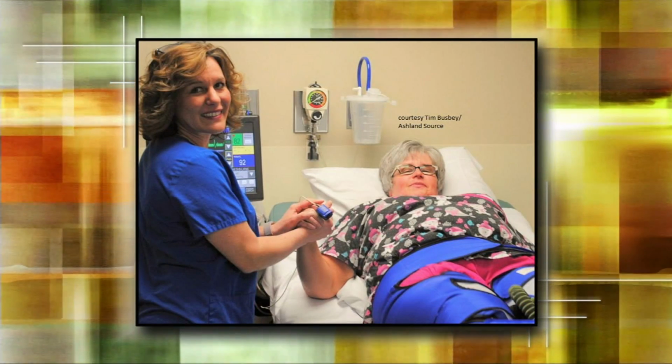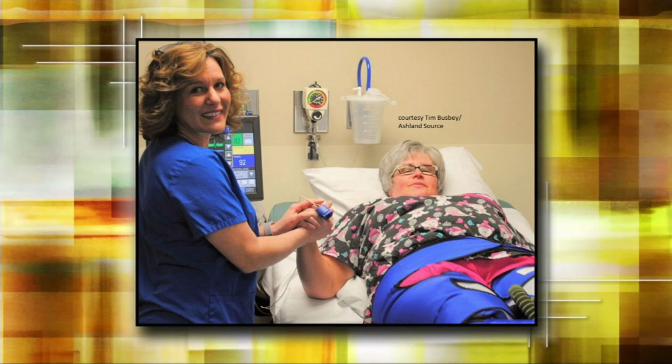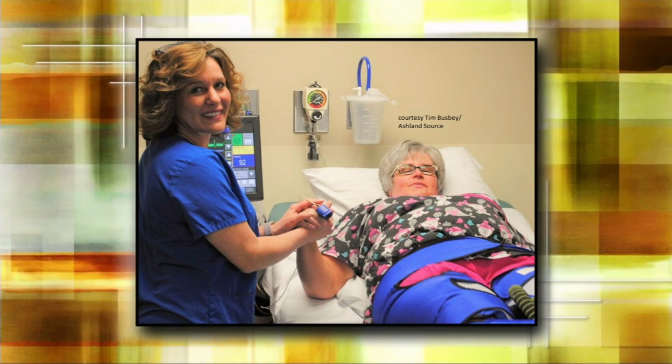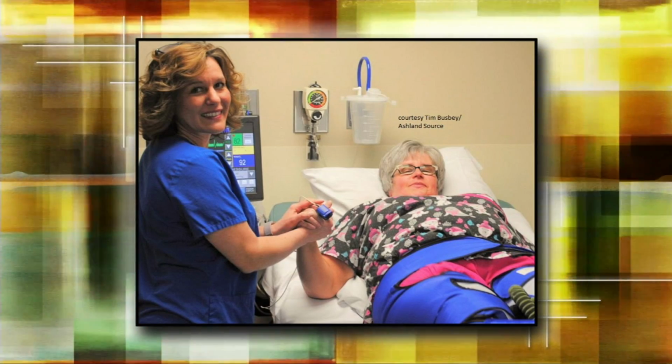Okay, so tell us how EECP works. Okay, well the patients come in and they run a treatment, and there's blood pressure cuffs that are on their calves, their thighs, and across their buttocks. Looks much like a blood pressure cuff. And they pump sequentially, milking blood up to the heart to increase the blood flow, circulation to the heart, so the next time it beats, it supplies blood to the entire body. Okay, so it's timed with the beating of the heart, right? It is. They're actually hooked up to an EKG monitor, and so it runs off timing of that. The nurse runs the treatment and syncs it to time just right.